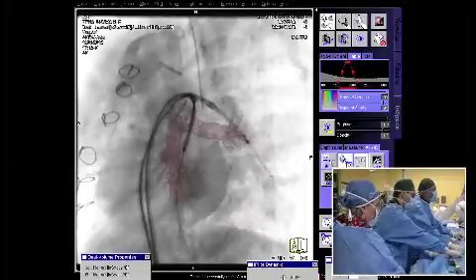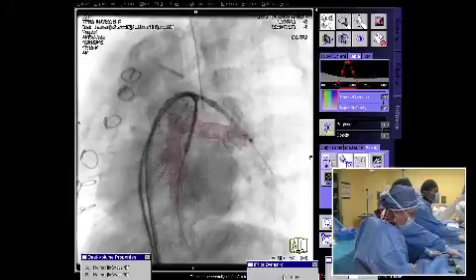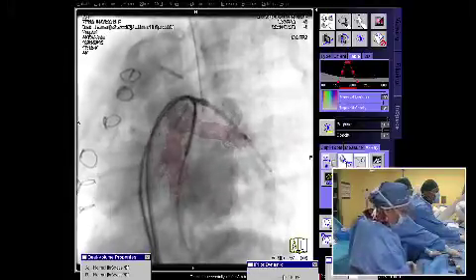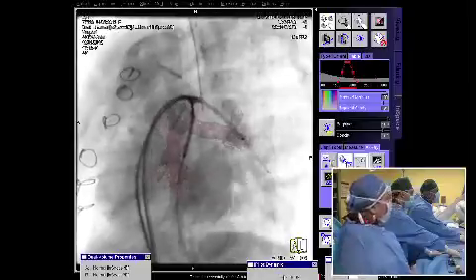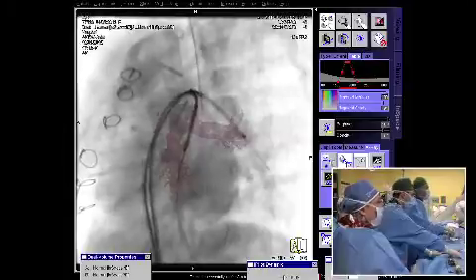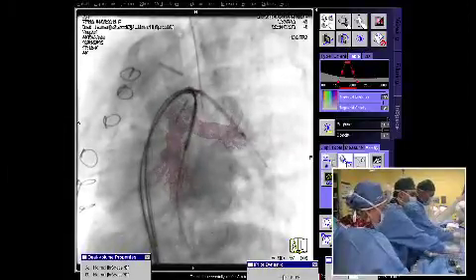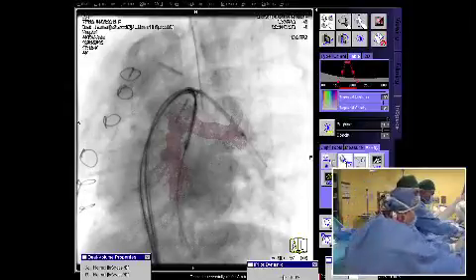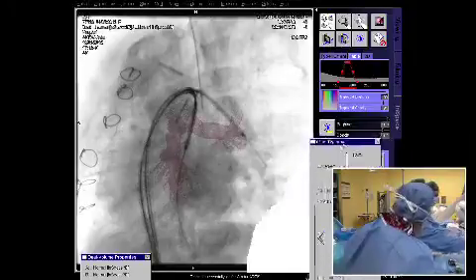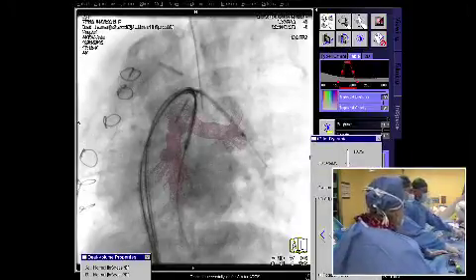The stent, you mean? Yeah, it's quite far in the LPA. You should really take the overlay off. It's only confusing. I stopped using it altogether because of it. Let's make another angio here for the left side. Yes, forget about overlaying and do a conventional angiogram on the side you want to place the stent.